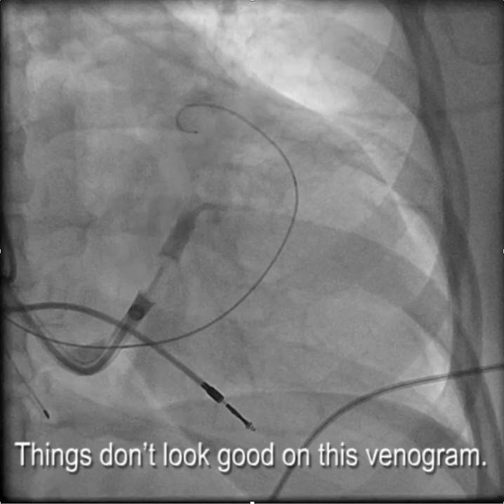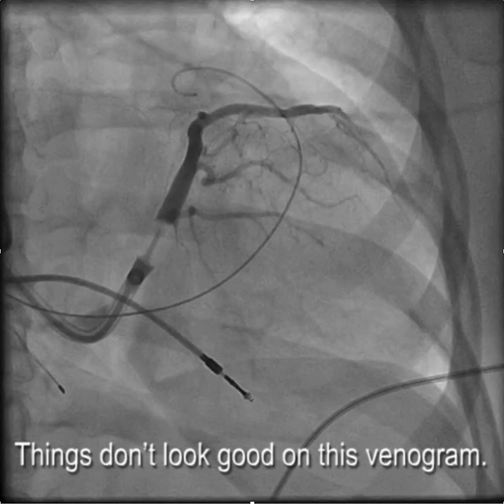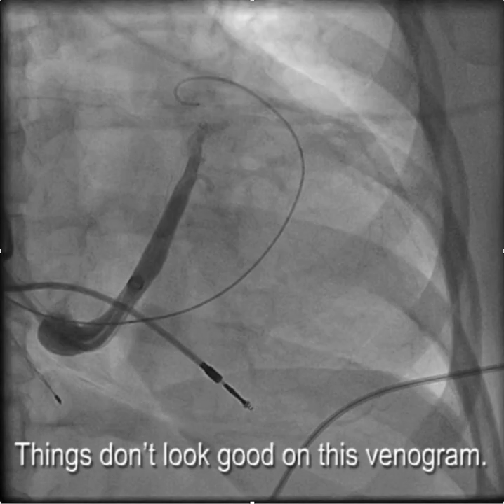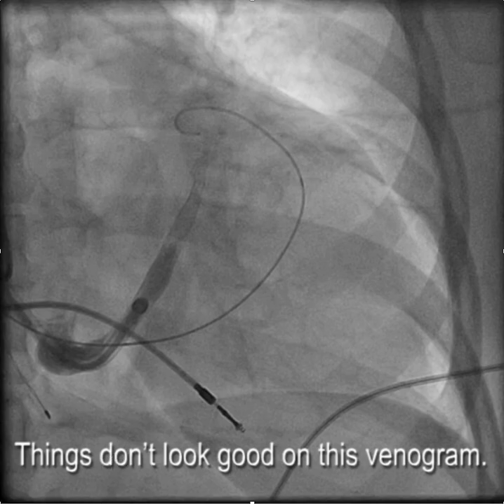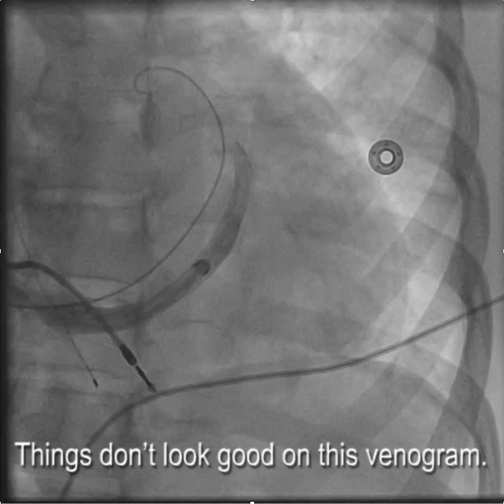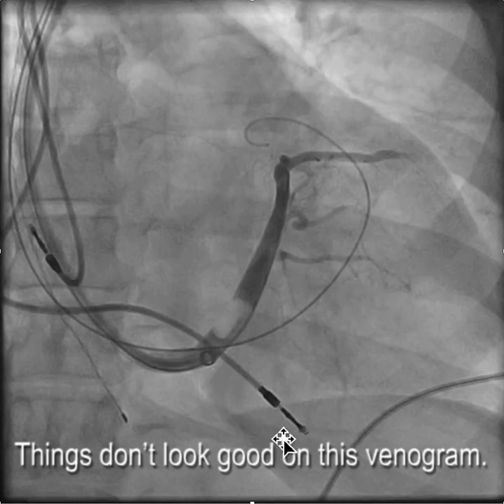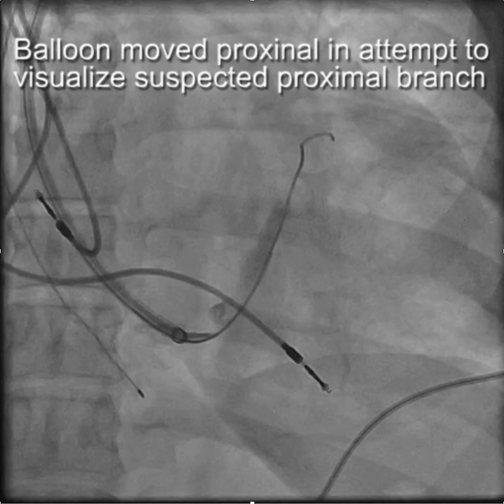An adequate coronary sinus venogram isn't as easy as it looks. In this case, the initial coronary sinus venogram was performed using full-strength contrast in an 035 lumen balloon, and the only target veins that were apparent were these two small branches, which weren't very promising. So additional angulations were taken, and it appeared that there should be something down in the lateral area — there should be a target vein down there, but nothing was seen.